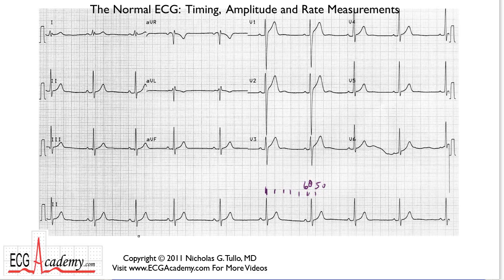Let's try it again. Here's one that lands on a heavy line. Counting: 300, 150, 100, 75, 60. Wait a minute — that's not the same. If this is 75 and this is 60, we're talking a rate of maybe 68 beats per minute. That's not the same as the other one.